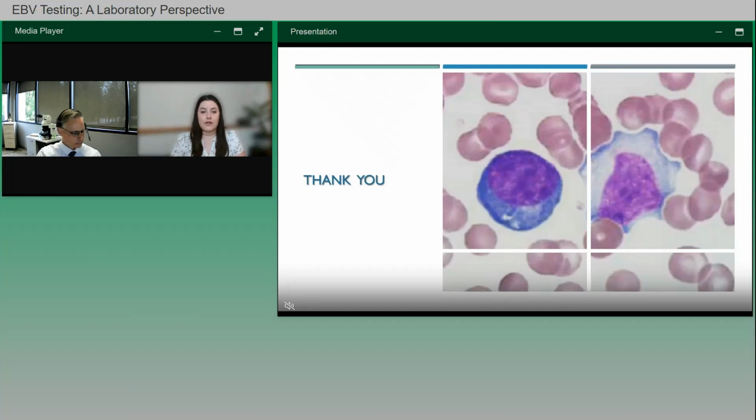Let's get started. Our first question is asking, since VCA IgG and EBNA both detect past infection, does one test have an advantage over the other?